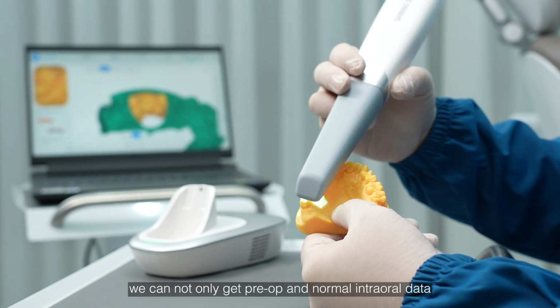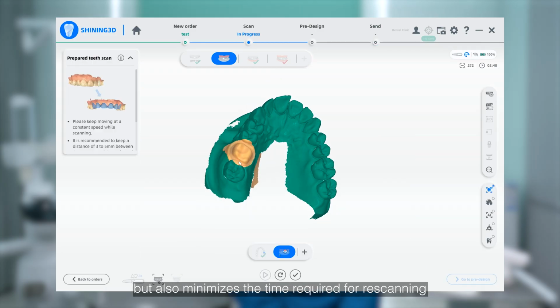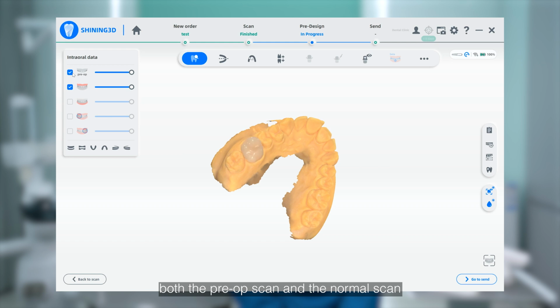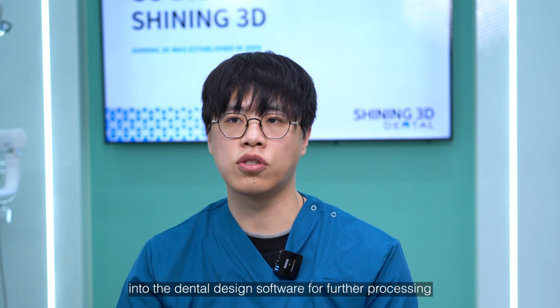In this way, we can not only get pre-op and normal intraoral data, but also minimize the time required for rescanning. Now we've got a project which includes both the pre-op scan and the normal scan. We can import both sets of data into dental design software for further processing.